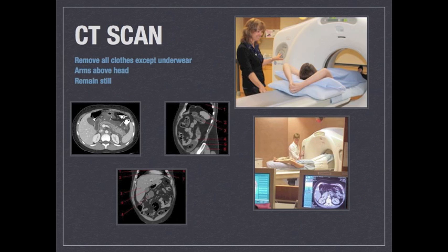Here, we ask the patient to remove all clothing except his or her underwear and explain what will take place once we place the patient on the table of the CT scanner. Next, you place the patient lying down facing up with his or her hands above their head to avoid artifacts. We then charge the contrast injector, which will be slowly administering the contrast intravenous.